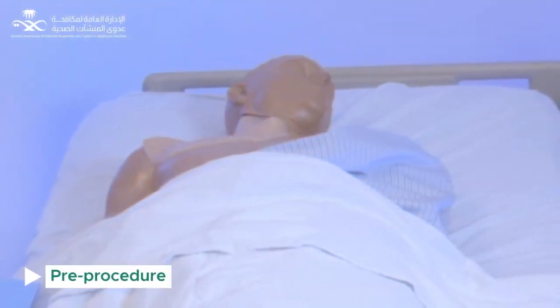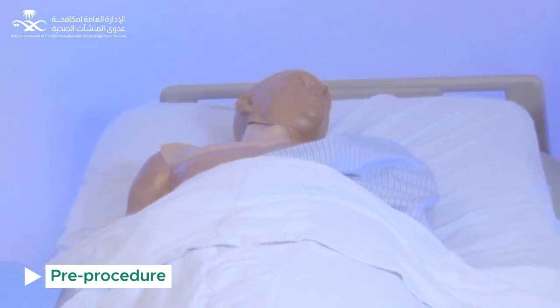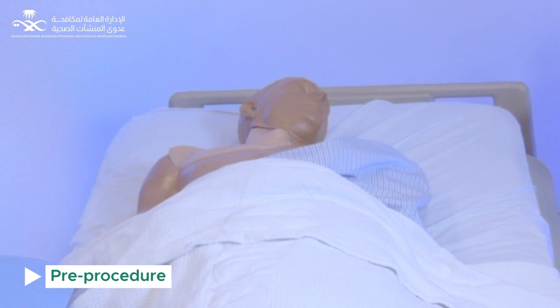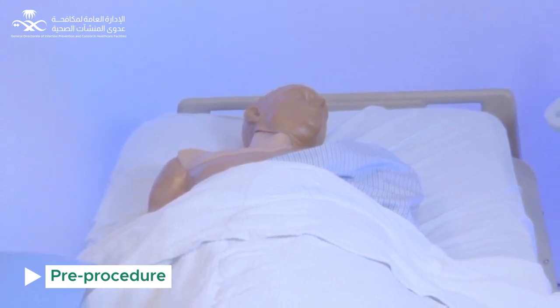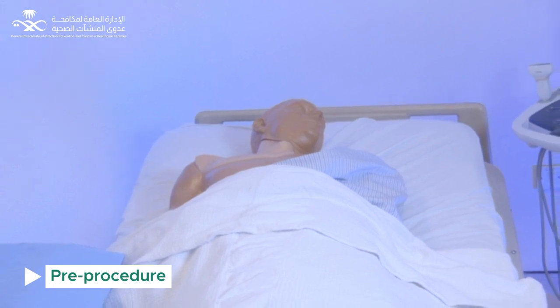Pre-procedure. When there is indication for central line insertion, check patient identification. Explain the procedure and risks to the patient or family and take the consent. Keep in mind to follow components of central line insertion bundles.